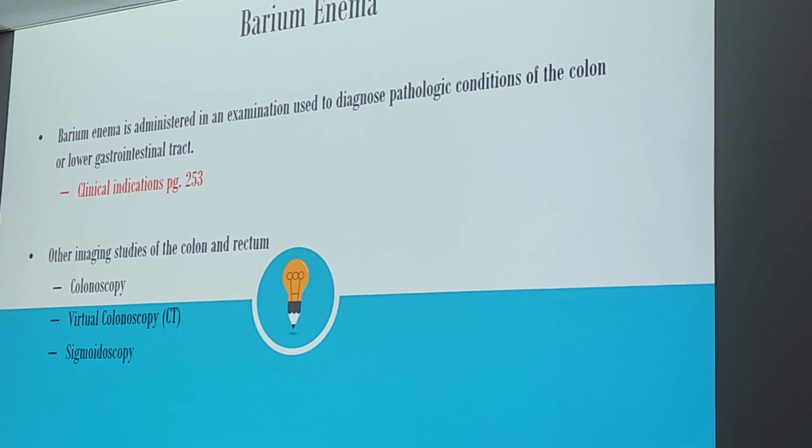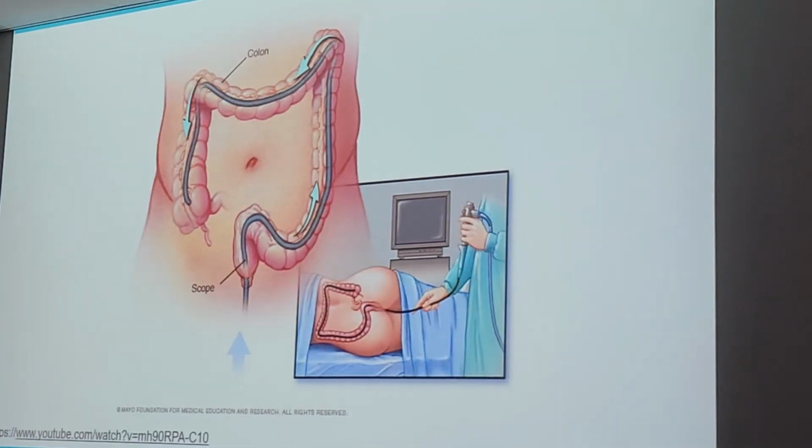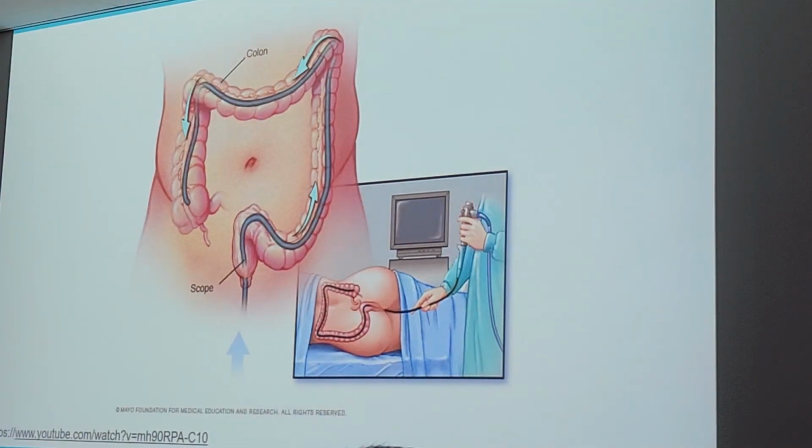Pardon my handwriting. Alrighty. So, what is colonoscopy? It's typically performed by a gastroenterologist or a surgeon. Takes about 30 minutes. It's a procedure where they insert a long plastic tube into your colon, and they're usually able to see the images on a display monitor.